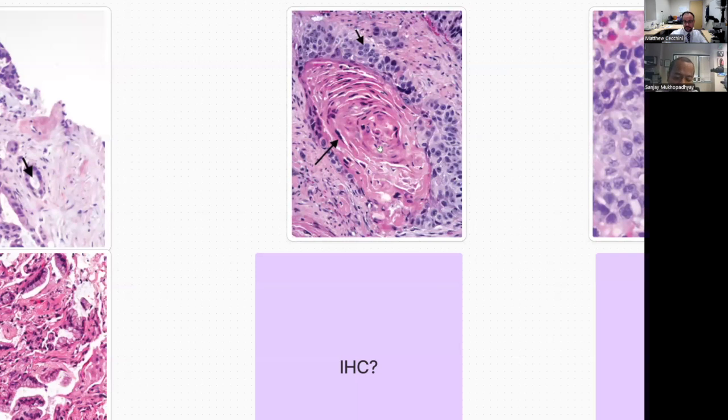Actually, the first author on that paper is my wife, Erica Dockstader. So she did this paper with Dr. Katzenstein where they looked at exactly this question: can lung carcinomas be P16 positive? And in that paper, from what I remember, almost a third of lung cancers were P16 positive, but none of them were high risk HPV positive. So if you use P16 and say, whenever P16 is positive, I'll call it a met from somewhere else, you will go wrong, because lung cancers can be P16 positive.